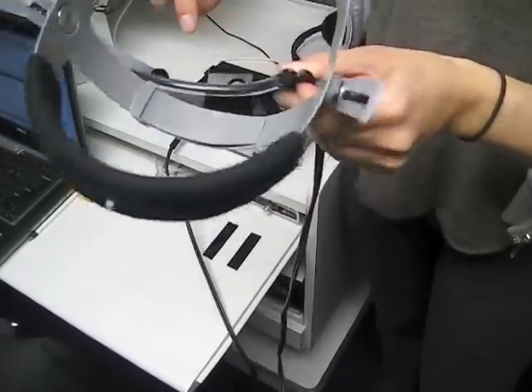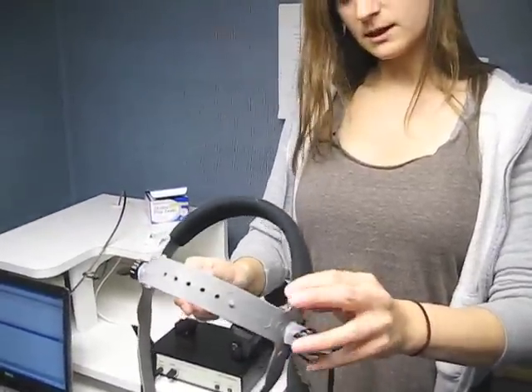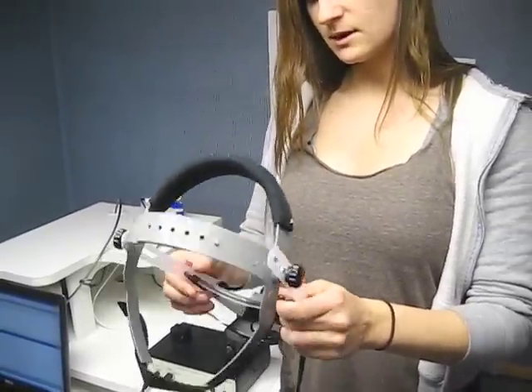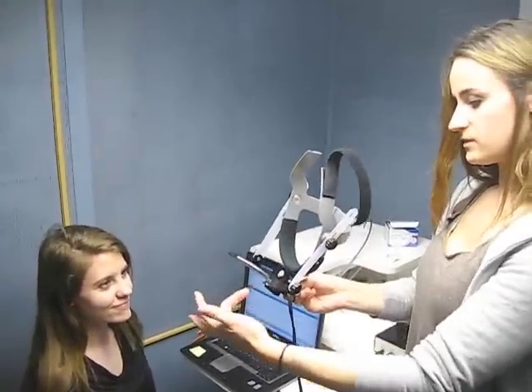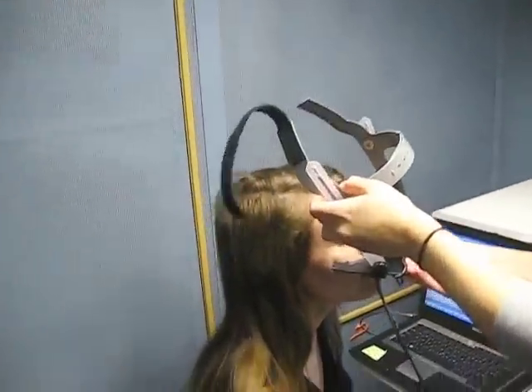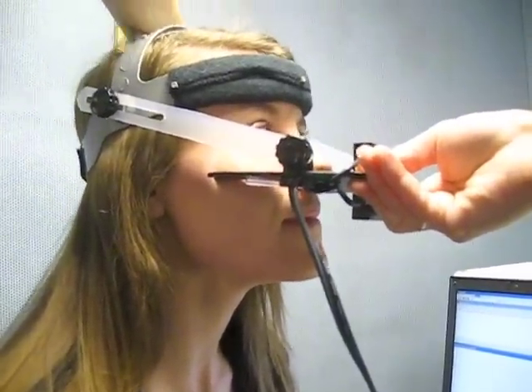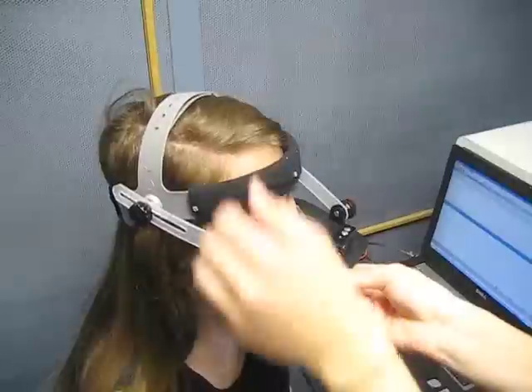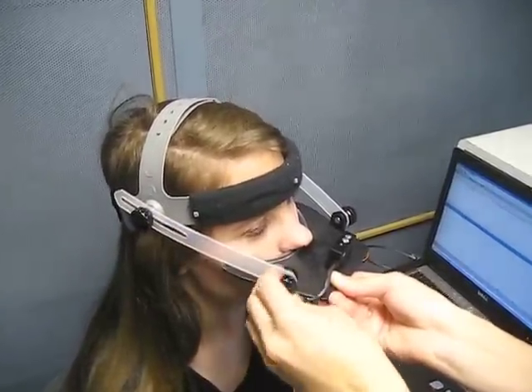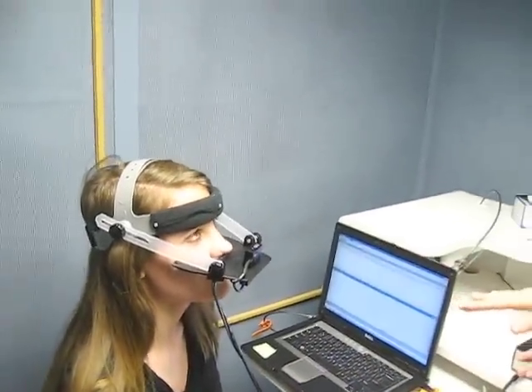Wipe the middle part that goes against the skin — anything that touches the patient. Make sure you don't touch the speakers with the alcohol wipes. These knobs loosen so you can fit it appropriately, so make sure the knobs are somewhat loose before you put it on so it's easy to adjust. Start by placing the face mask part right in between the lips and the nose, then place the forehead band on the forehead and velcro the back part. Tighten the knobs to adjust it to fit the front and back of the head, then tighten the knobs that keep that part secure. Always make sure it's not too tight.